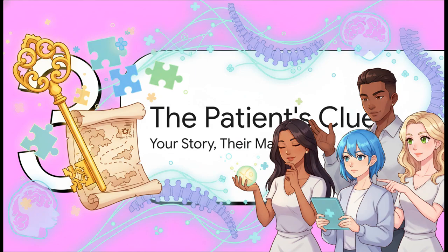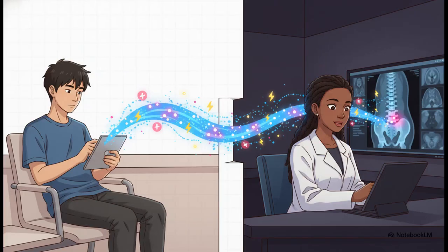Well, it turns out to be something beautifully simple. The key that unlocks this whole puzzle comes directly from you, the patient. Your personal story is the treasure map that leads everyone to the right spot. And the tool they use to capture that treasure map is surprisingly low tech, just a simple pre-MRI questionnaire. Before you even get into the scanner, you fill this out, describing your symptoms in detail. That information then goes straight to the radiologist. And believe me, it completely changes the game. It changes how they see your scan.